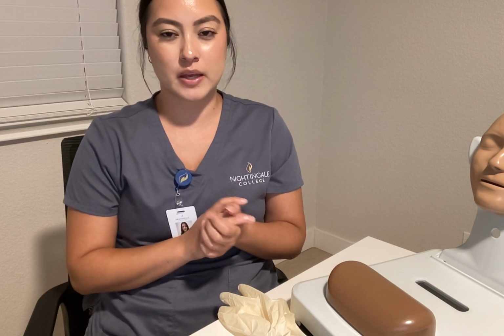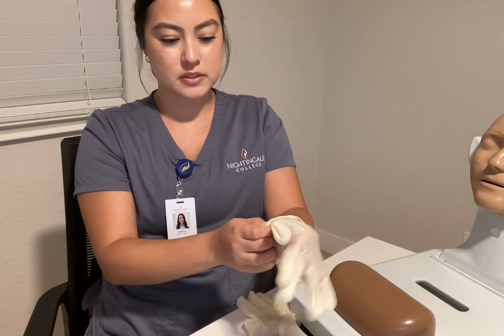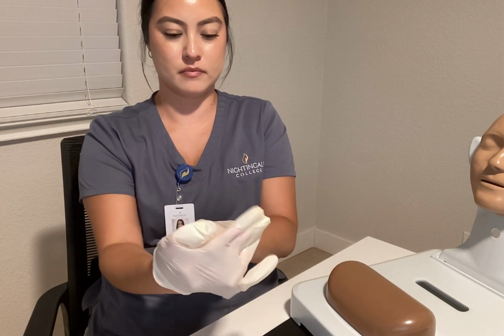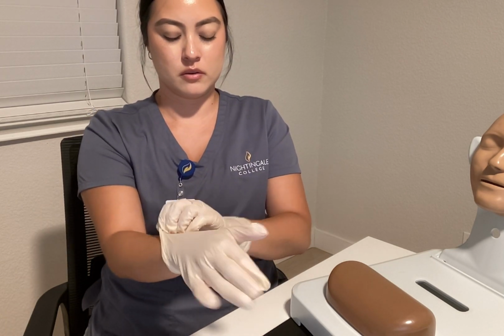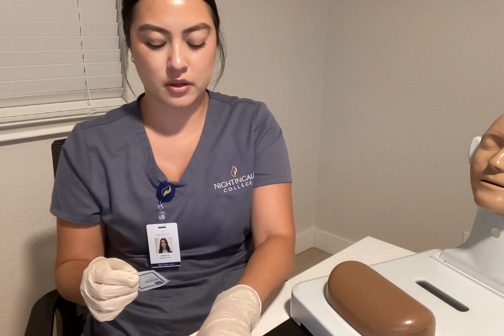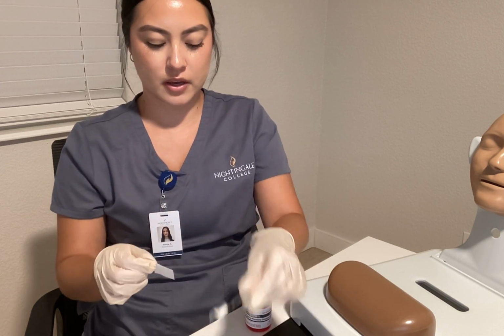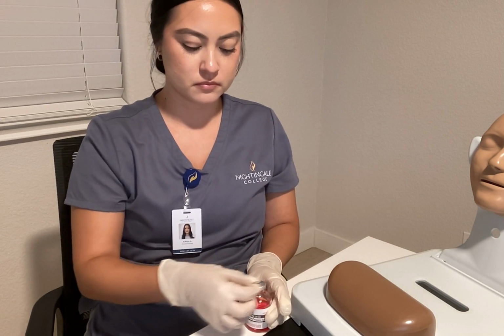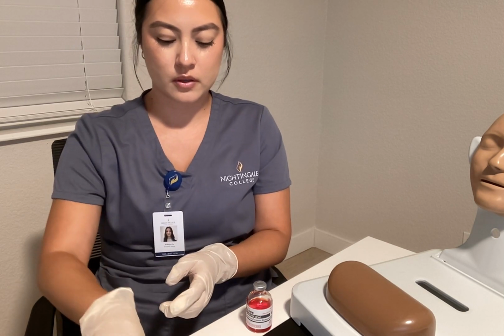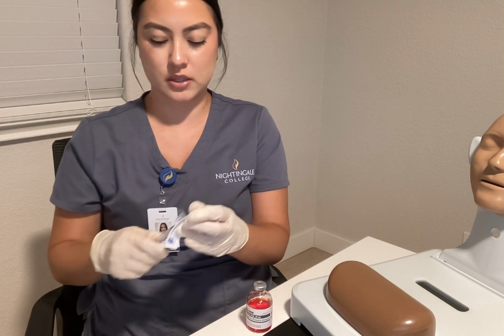I'm going to go ahead and draw up my medication now. I would perform hand hygiene and don my gloves. Now that we have our gloves on, we're going to draw up our medication. I'm going to start by cleaning our medication vial. And then I'm going to take my syringe, and I'm going to take my needle, and we're going to attach this, twisting it on.